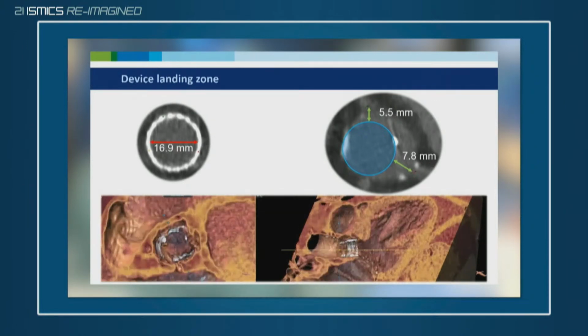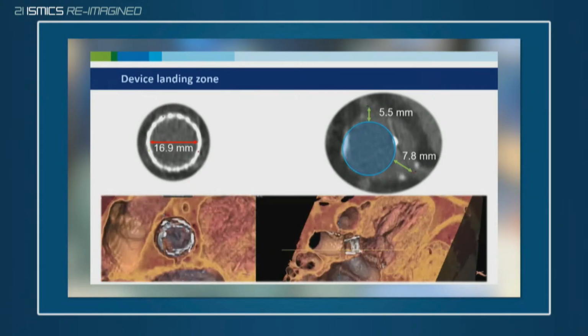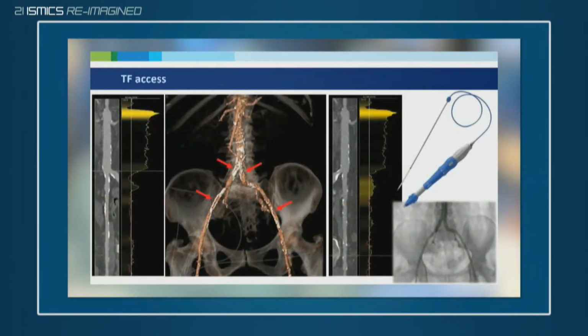After analysis of our CT reconstructions, we found a safe virtual transcatheter heart valve to coronary ostial distance. Looking at the vascular tree, which gives us some information about calcifications, stenoses, or soft plaques, we opted for the left side for main femoral axis of device deployment.